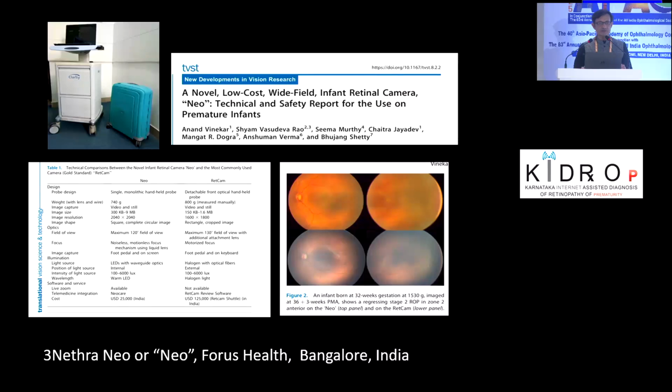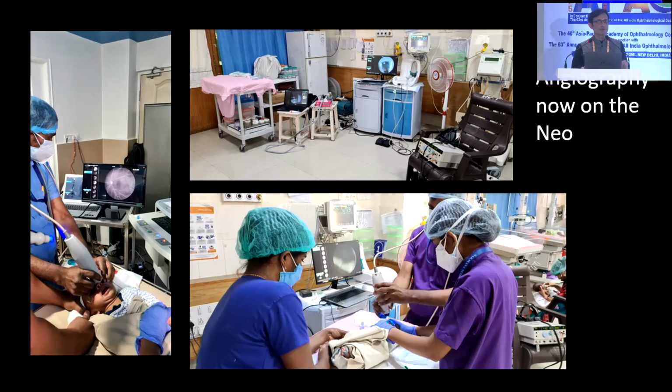Let's talk about a few of the newer imaging devices. So in our own program, in the KidROP program, we have a telemedicine program where we started to use the RetCam Shuttle. It's wonderful. It gives us great images, but the program was not scalable because of the cost of the camera. So this was an Indian camera that was invented, and I believe it has an FDA and a CE approval, and now has installations everywhere.